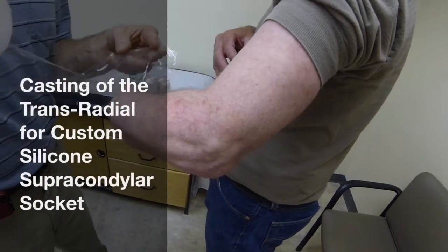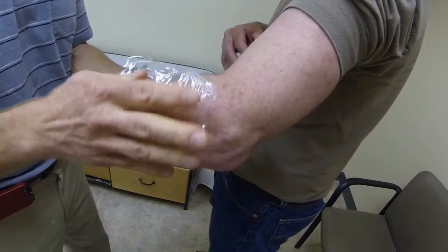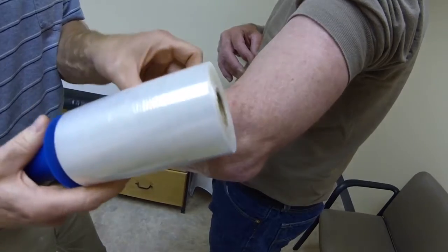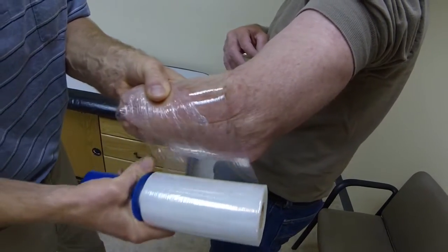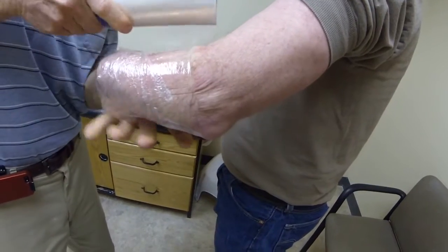This video will present a technique for casting of the transradial residual limb for a custom silicone supracondylar socket. The limb is first prepared by wrapping with plastic wrap, which serves to pre-compress the tissue and is a separator from the plaster bandage.